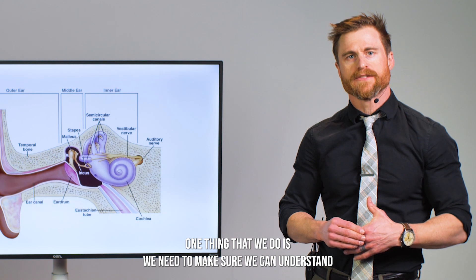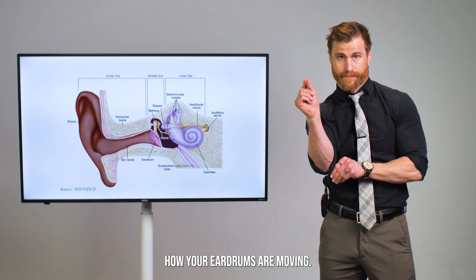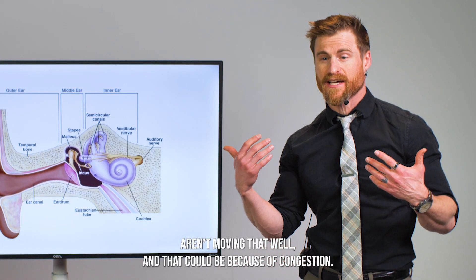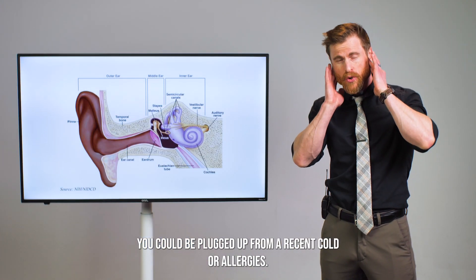One thing that we do is we need to make sure we can understand how your eardrums are moving. Sometimes your eardrums aren't moving that well, and that could be because of congestion. You could be plugged up from a recent cold or allergies.